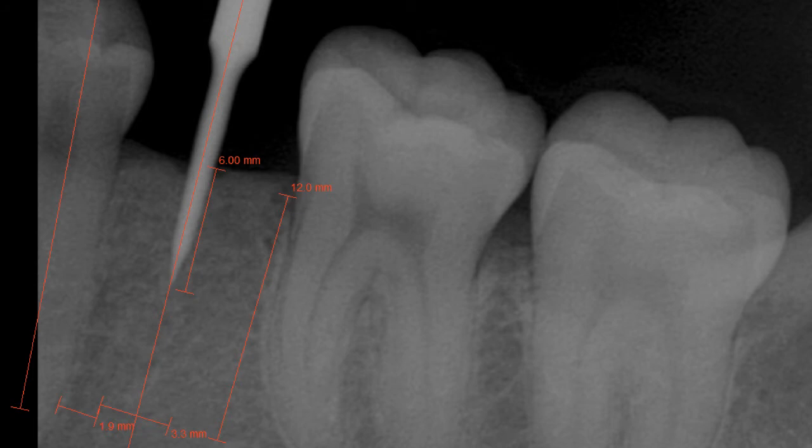In this radiograph, the BTI initiator was inserted only 6 millimeters before I took the first radiograph. I don't want to insert my primary instrument all the way to full length, just in case I need some adjustments to be made to my angulation or positioning, such as here. We can determine I am pretty centralized between the molar and the premolar, so I am happy with my positioning mesiodistally. I drew, using the software, these red lines vertically from my drill, top to bottom, and the premolar top to bottom, and made sure that they're parallel.